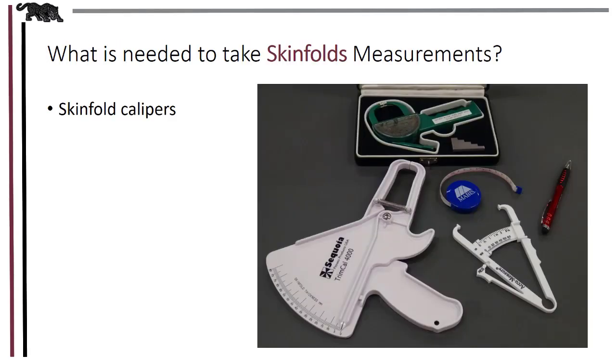In order to conduct skinfold measurements, you first need skinfold calipers. Calipers are made in different qualities. One of the most preferred when most precise measurements are needed are, for example, Lange calipers. Plastic calipers are less expensive, but all calipers are made to be held in the right hand, and most have units of measure in millimeters.